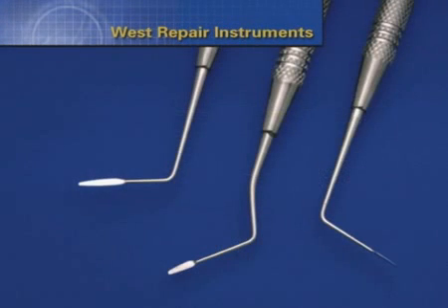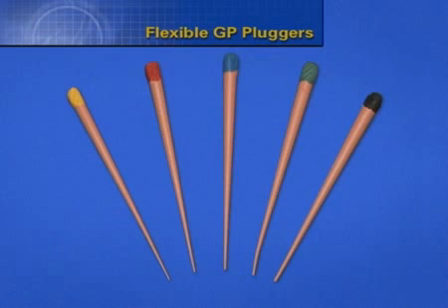The West Perf Repair instruments provide thin, flexible trowels angled at different orientations. These instruments carry, position, and adapt materials into more coronally positioned perforation defects. Gutta-percha cones, utilized as flexible pluggers, offer yet another option to shepherd or pack materials into place. The gutta-percha cone is customized by trimming its apical extent so that it has sufficient diameter to effectively work. Importantly, this customized cone should fit freely through the perforation defect and not bind onto structure.